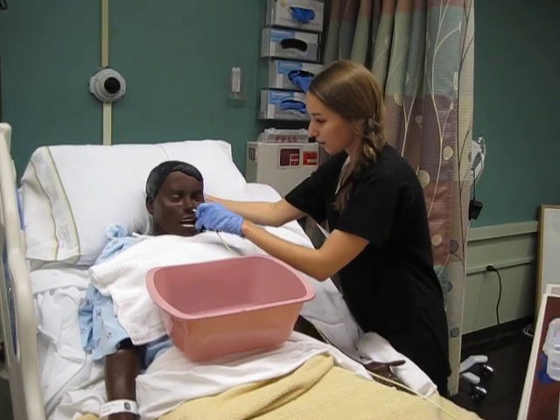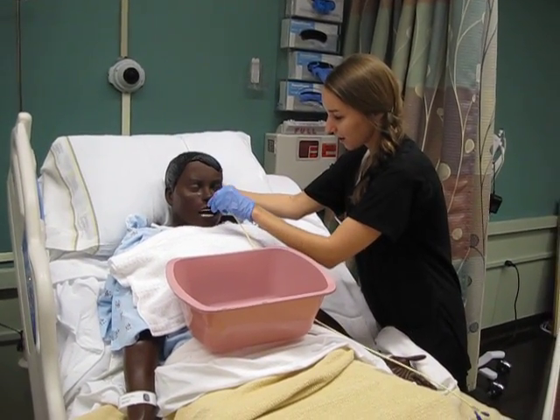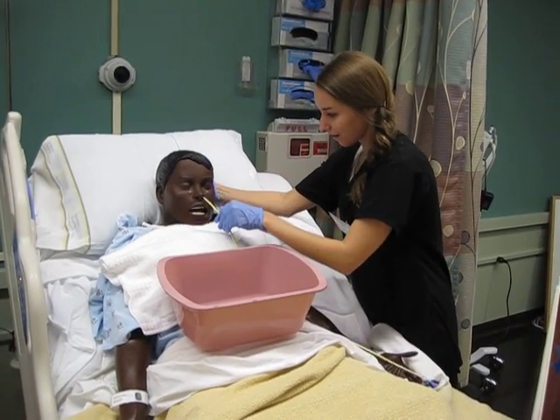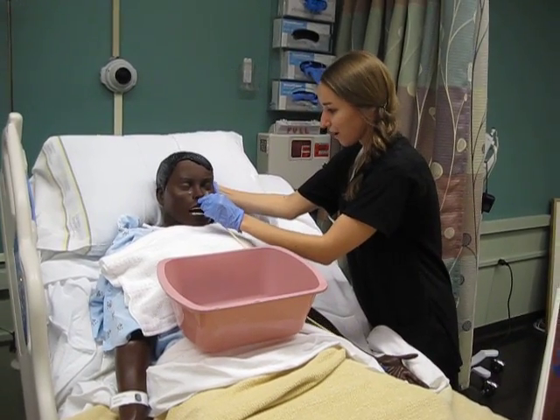Let's put your head up. Swallow for me. Good job. Keep swallowing. You're doing great. Keep going. Swallow. Swallow. One more big swallow. Perfect.